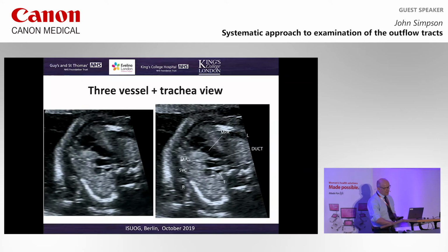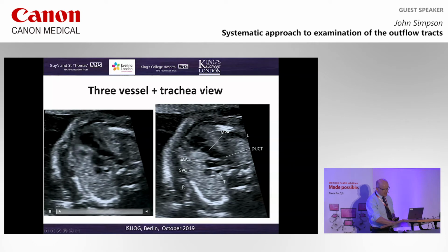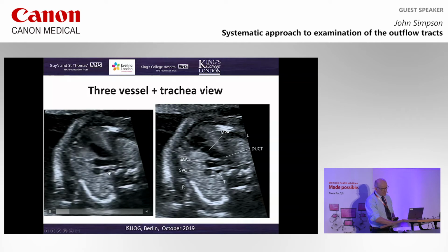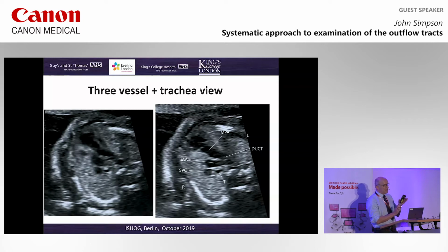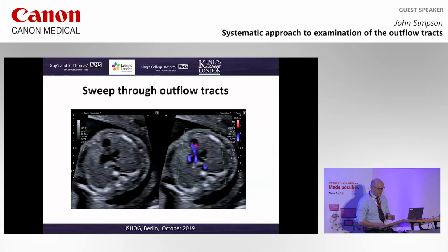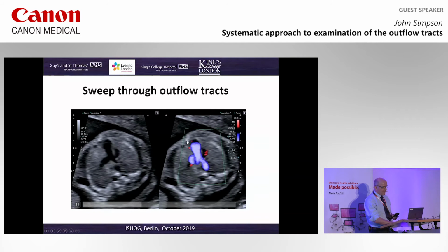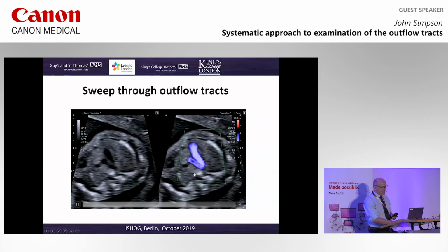And here's the sort of typical shot that we'll see, where we're seeing the pulmonary artery straight back, the transverse aortic arch, the SVC, and you can see the trachea here is outside of the V made by the aorta and the arterial duct. So the trachea is not between any of the vessels, it's outside both of those vessels. And in practice, what we're generally doing is a sweep. So you're looking from the right ventricular outflow tract AP and sweeping up into the three-vessel trachea view. Trachea is just in here.